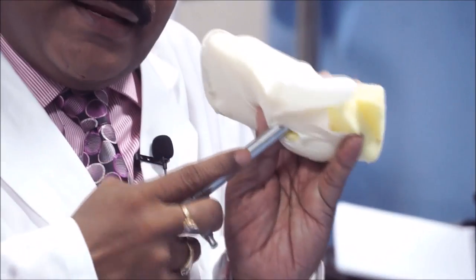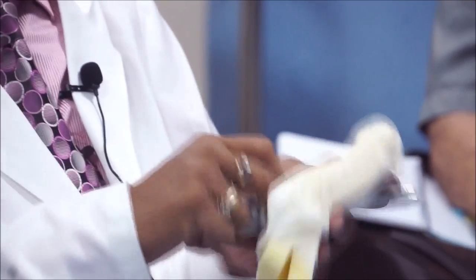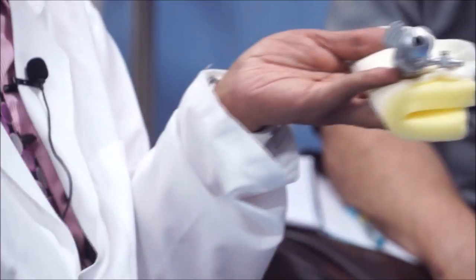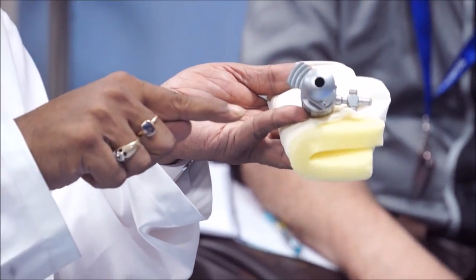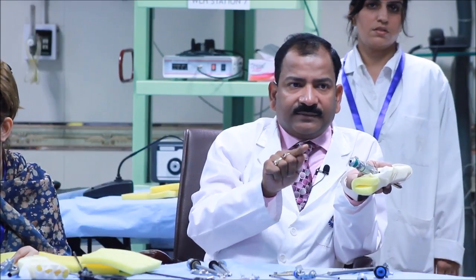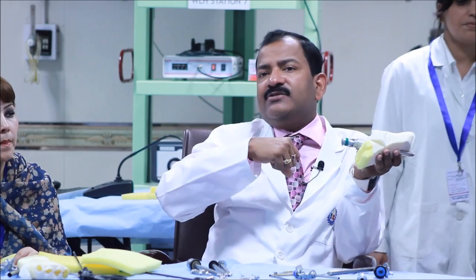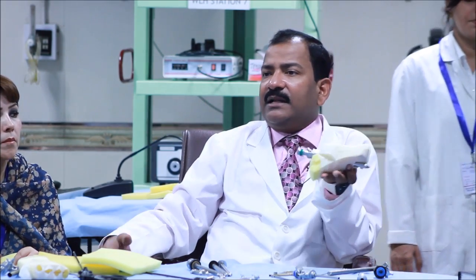Then you go that way, and then again you go this way. So Kathodia described that the skin is here, then you go like that, then like that, then like that. So the skin opening is here and the peritoneum opening is there. The advantage is that as soon as you take the trocar out, all the layers overlap each other and there will be no hernia.